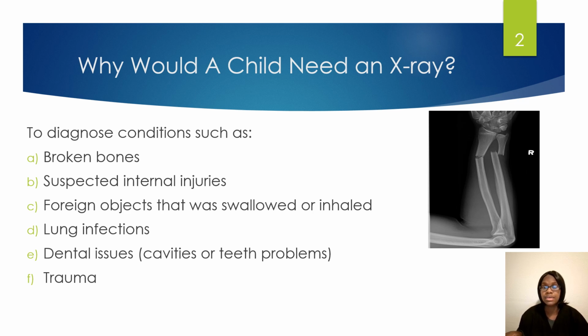And this x-ray right here is an image of a fractured bone of the forearm. I know whenever I was 7 years old, I did fracture my forearm. So if a patient comes in and they are a child or maybe a baby, just try to be as patient as possible with them because they may be afraid. I know I was afraid because a lot of people were around me whenever I had to go inside of the x-ray room. So whenever we see that big camera, whenever you are a child, you probably tend to get scared. But I have had children that were 6 and 7 that didn't have a problem with the x-ray machine.